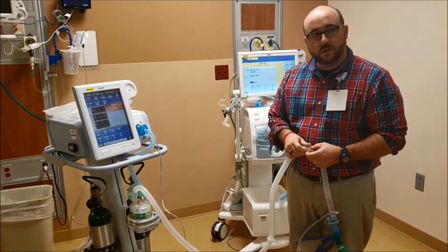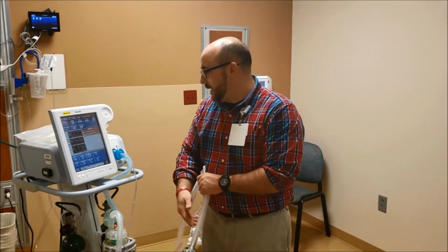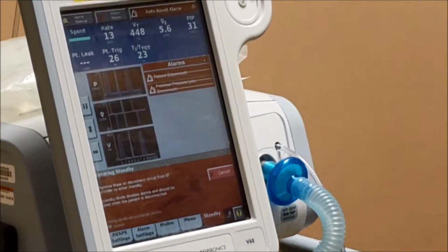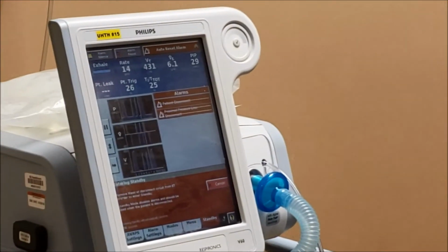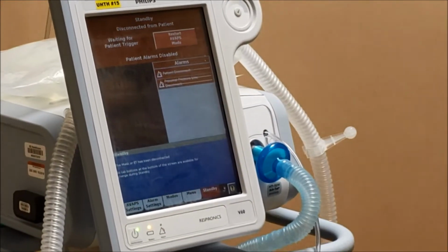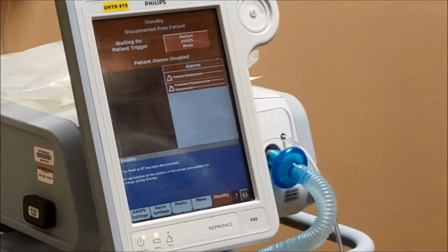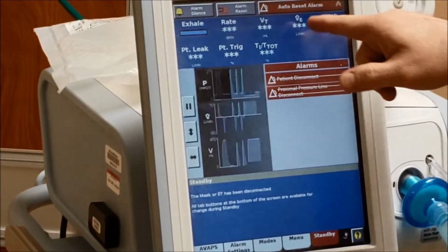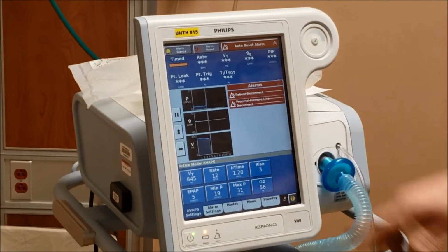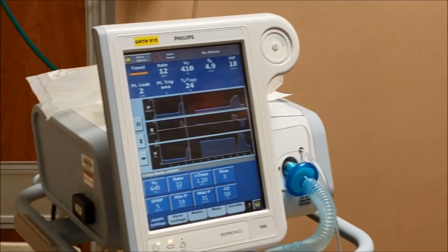So if we set that up, is it on standby, like while we're waiting on the patient to come? Yeah, it's got a really cool standby on it. So if you hit the standby, it's like that disconnect button over there, where you just take this thing off. And it sits like this. It just kind of waits. Now the difference is with this one, you plug it in. Oh, it automatically restarted. And I always hit that just in case, but auto reset alarm. So we reset the alarms, and then you can go on right here doing this thing.